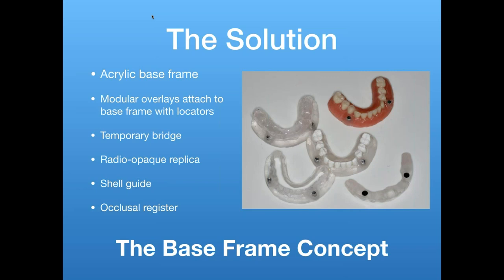So the modular overlays: we have a temporary bridge that we want to be putting straight onto the implants after they've been placed, a radiopaque replica of that temporary bridge, something that I call a shell guide, and latterly I've developed a newer modular overlay, an occlusal register. And this is what I've called the base frame concept.